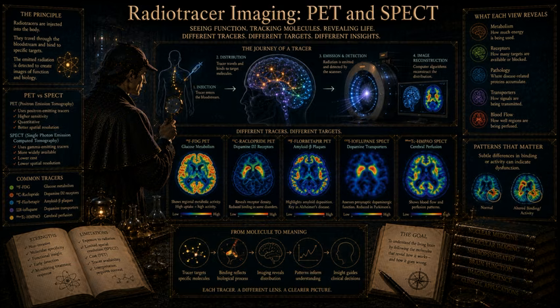Okay, explain the mathematical magic of the reference tissue. How do we bypass the blood? It relies on finding a specific region in the brain that is biologically distinct from the region you want to study. Let's say we are studying D2 dopamine receptors in the striatum. Through postmortem biology, we know that the cerebellum, the large structure at the back of the brain, is virtually completely devoid of D2 receptors. There are 0 VIP parking spots in the cerebellum.